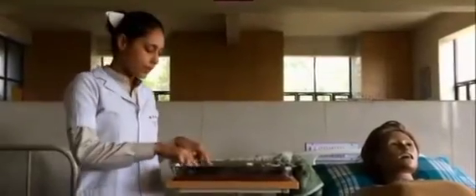Now we will see the parts of the Ryle's tube. So this is the Ryle's tube. It is also called a nasogastric tube. This nasogastric tube is available from 10 French to 20 French, and this is the 16 French Ryle's tube. If the doctor advises 16, it is written here. This is the 16 French Ryle's tube. The length of the Ryle's tube may be 105 to 120 centimeters.